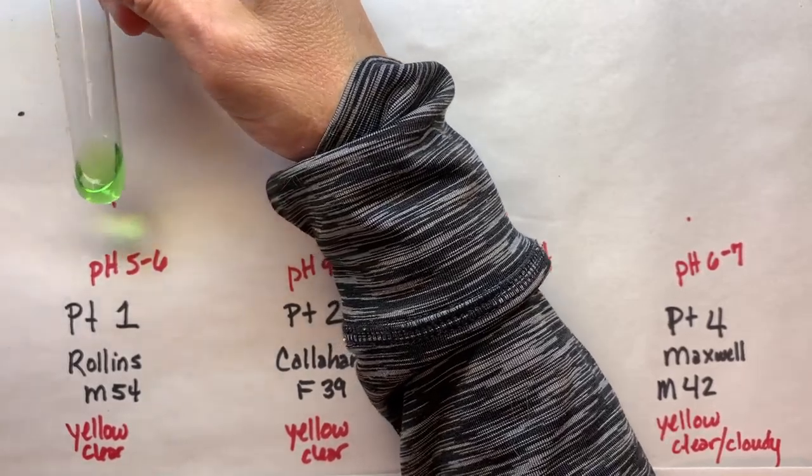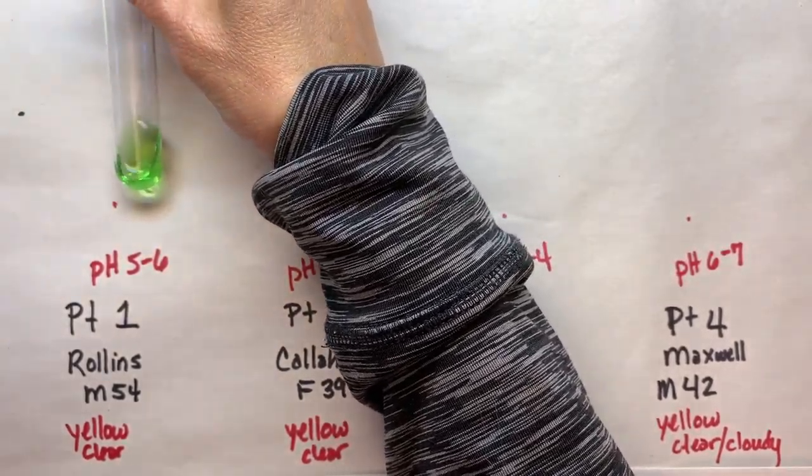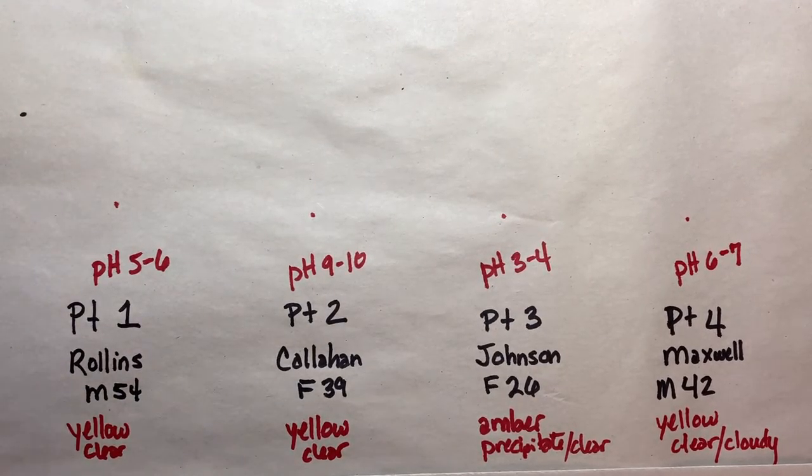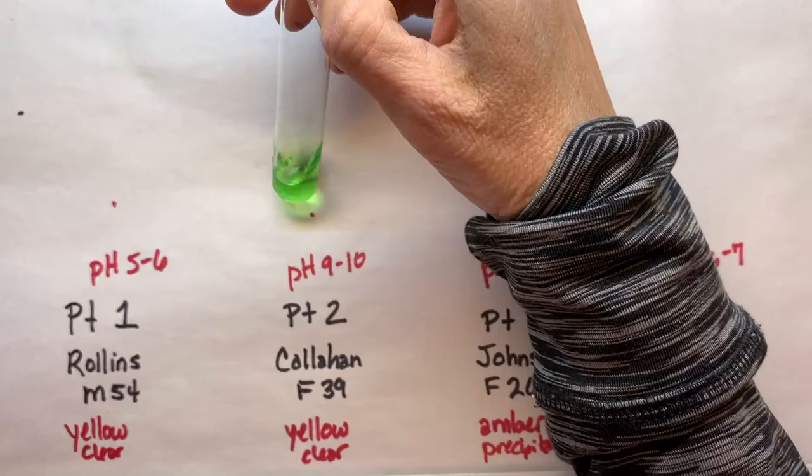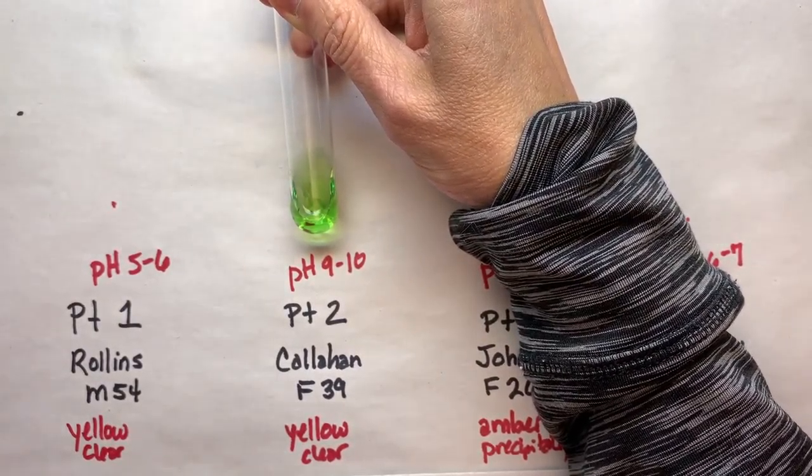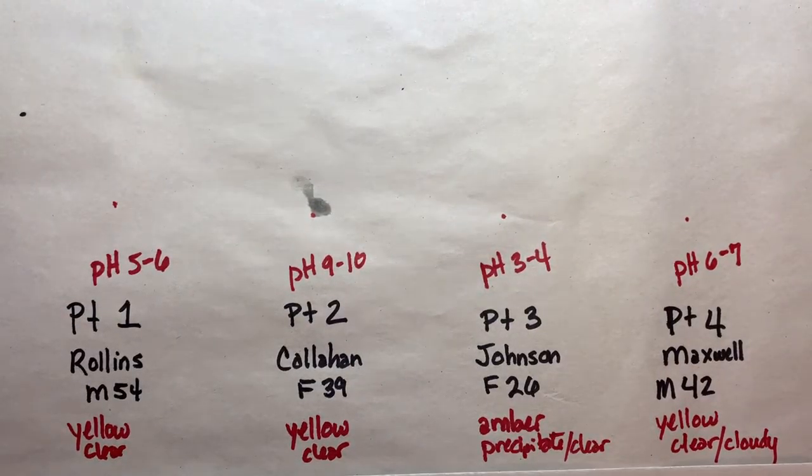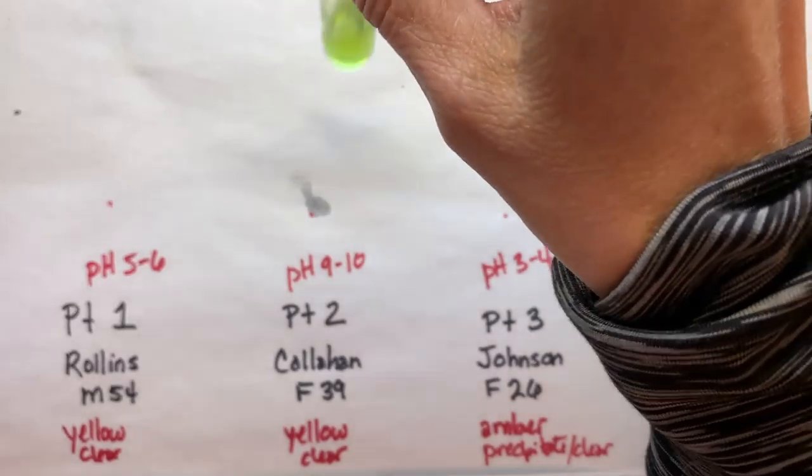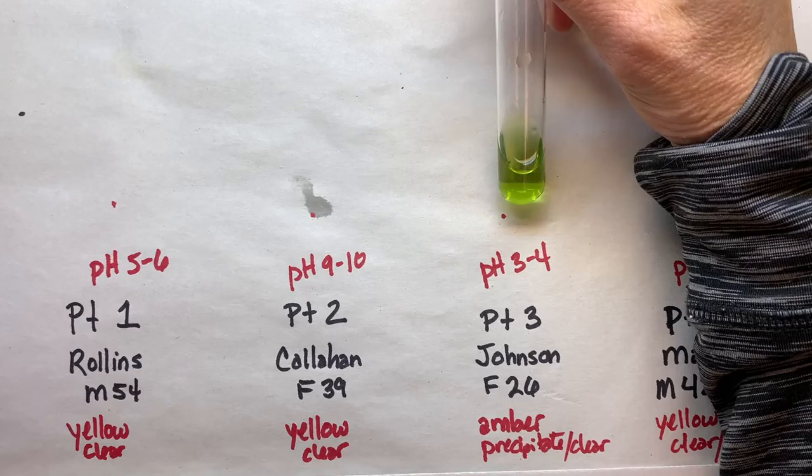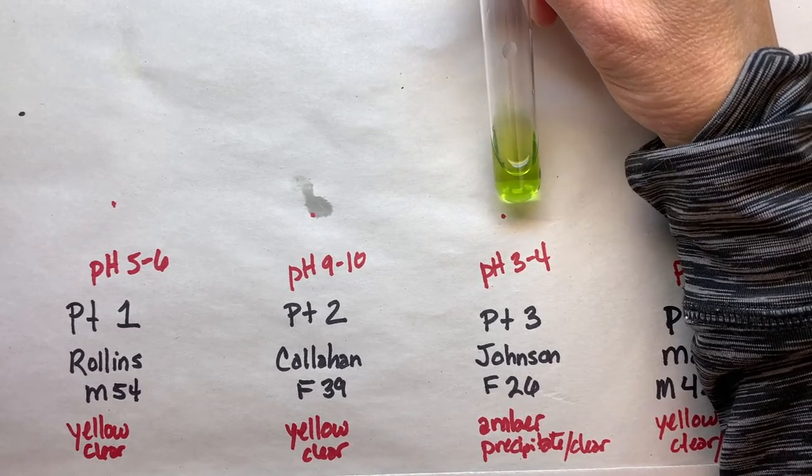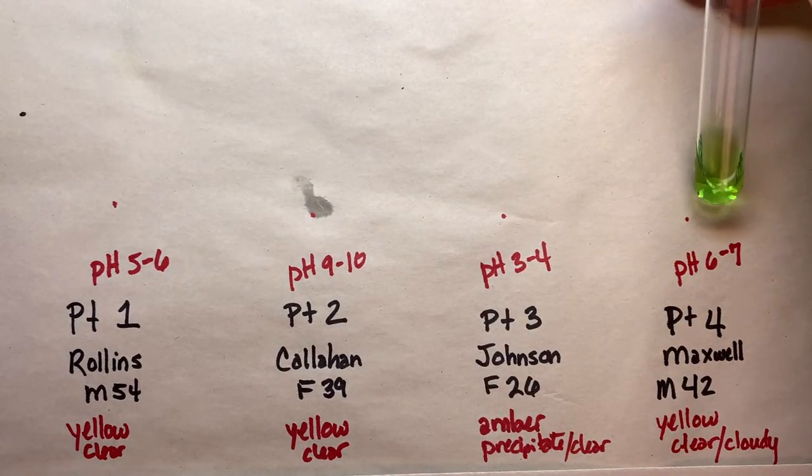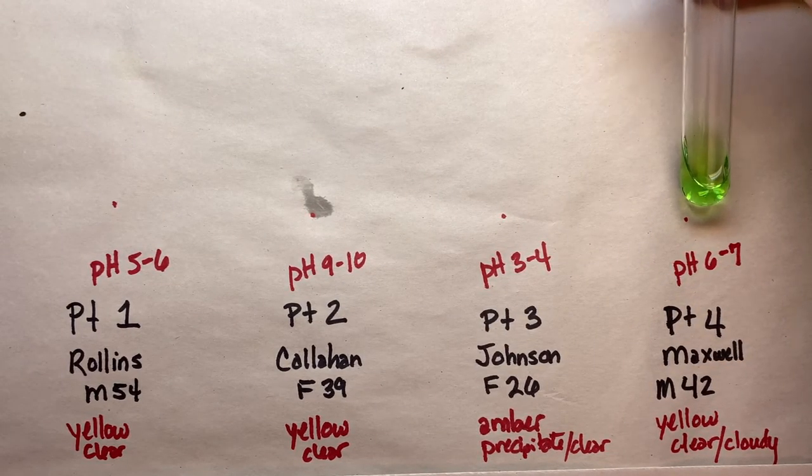Patient number one's urine is this nice green, here we can see that. Patient number two, again, green. Patient number three, I think that's about the same green, right? And then patient number four, again, a green.